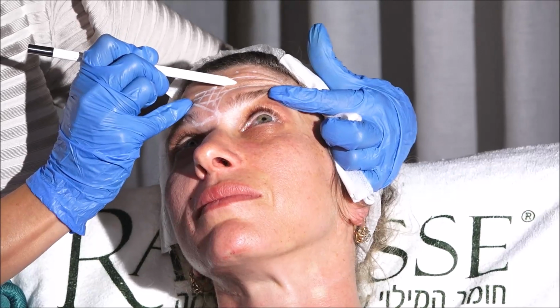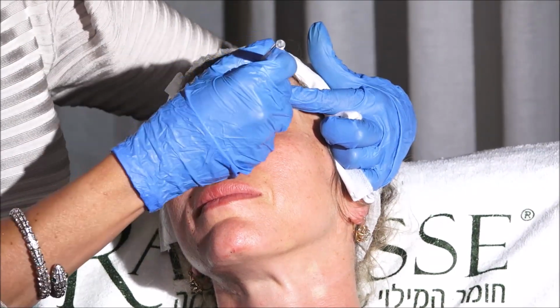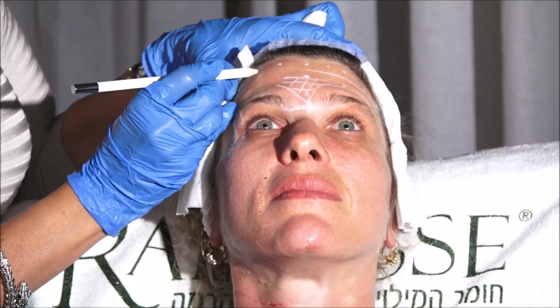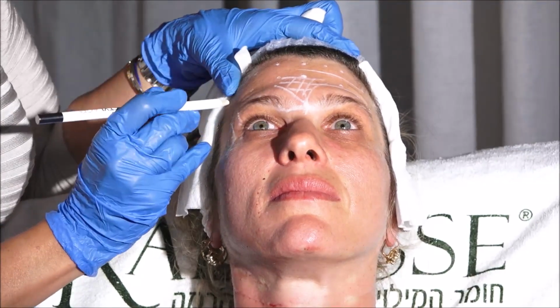So 2 centimeters to the side, 2 centimeters to the side, 2 centimeters. Then I have to go 2 centimeters down, right? My next point, 2 centimeters down, and then 2 centimeters, 2 centimeters, 2 centimeters. The same in this side, 2, 2, and here 2 down, 2, 2, and 2.